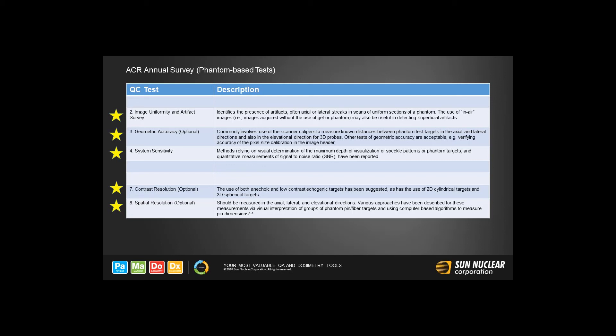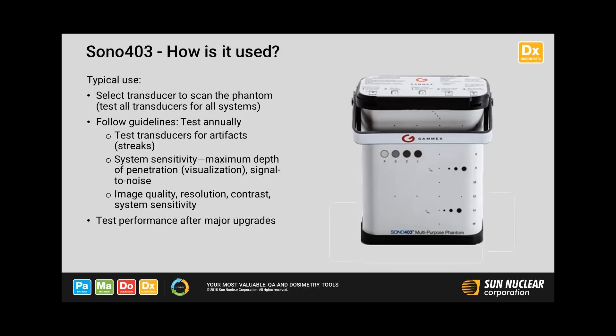To summarize, ACR QA tests need to be done for each transducer and each scanner in the facility. Those done by imaging the SONO 403 phantom include image uniformity tests, geometric accuracy tests, both vertical and horizontal, system sensitivity done using a depth of penetration, and this is done at both a fundamental and a harmonic frequency, and then the optional contrast resolution and spatial resolution could be done rigorously, but here we only generated images for qualitative assessments to be used from one annual survey to the next. These tests fit well within the intended applications of the SONO 403 phantom. Besides its use for routine tests, such as annual surveys, we recommend that the tests be carried out after a major upgrade, such as a software upgrade, to the ultrasound imaging system.